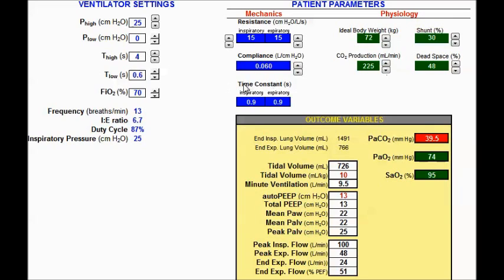The time constants will change based on these compliance inputs. Under physiology, I'll enter an ideal body weight of 72 kilograms, which we'll keep constant. We'll look at the outcome variables — specifically what tidal volume is generated, whether it is lung protective, and auto-PEEP. This is a brief introduction to the APRV simulator.